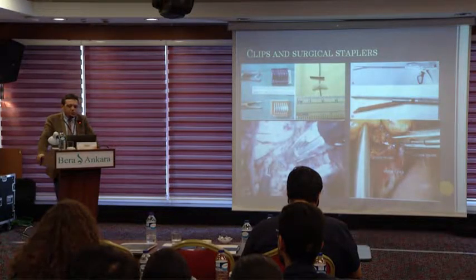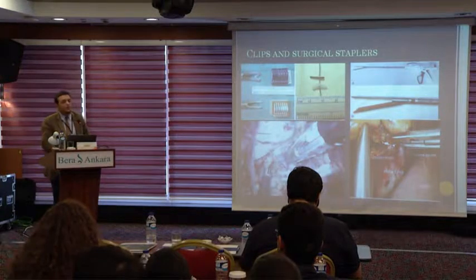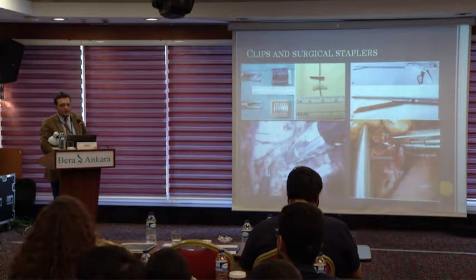We shouldn't leave any titanium or Hem-o-lok clip in the stapling area, so we will have some trouble with opening it.